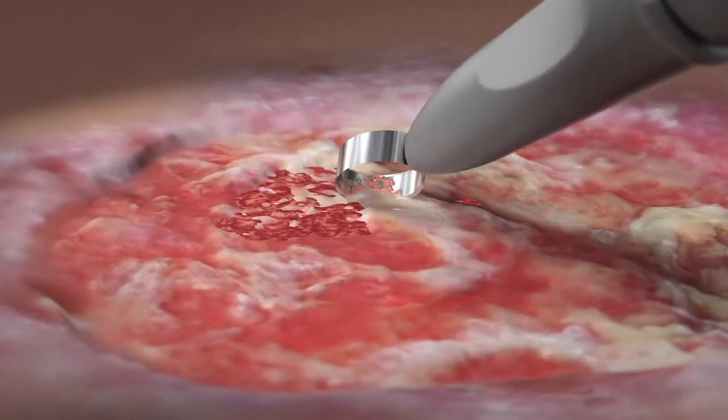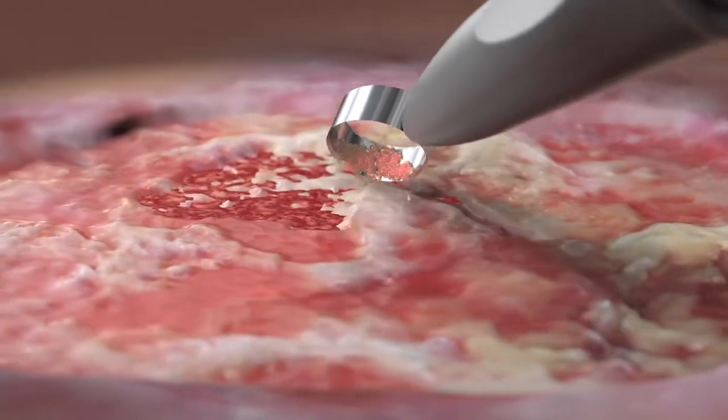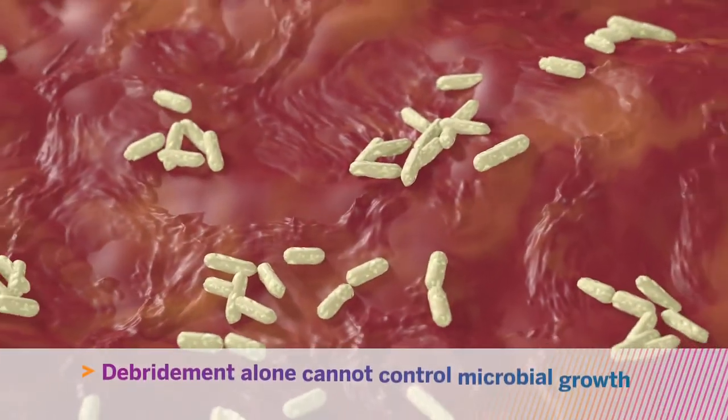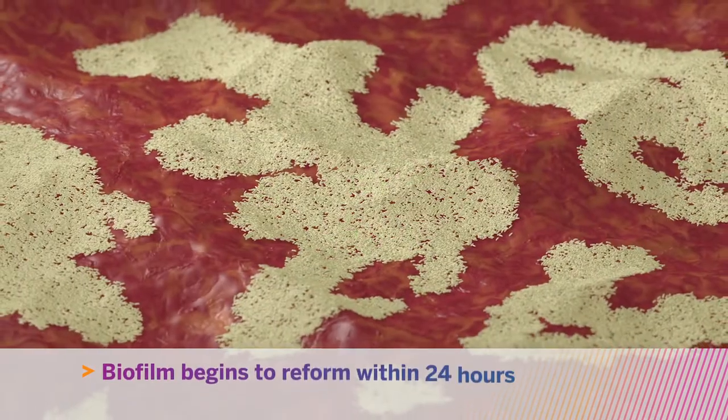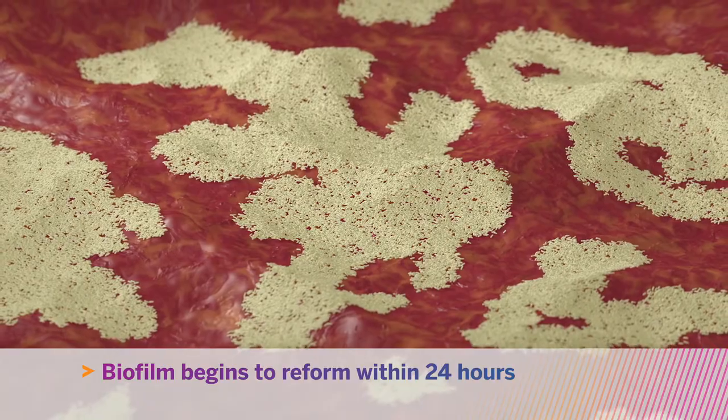Although frequent aggressive debridement is an important part of wound management, it is not sufficient to control microbial growth or prevent biofilm reformation, potentially interfering with wound healing.